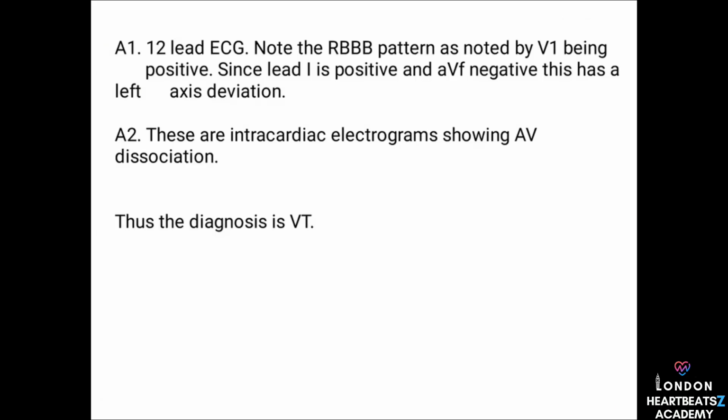Okay, so we've got the wide QRS complex, the right bundle branch block, and now AV dissociation. What does that all point to? All signs point to ventricular tachycardia. Ventricular tachycardia. Wow, that's serious stuff. It's amazing how these lines can tell such a big story. Absolutely. Now let's move on to figures B1 and B2, another case of wide QRS complex tachycardia.